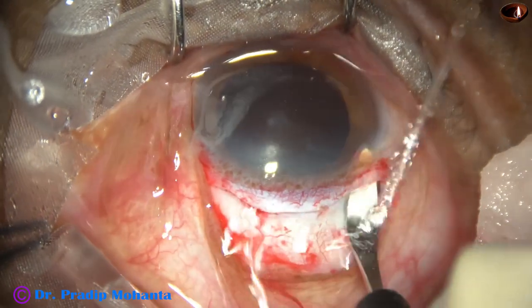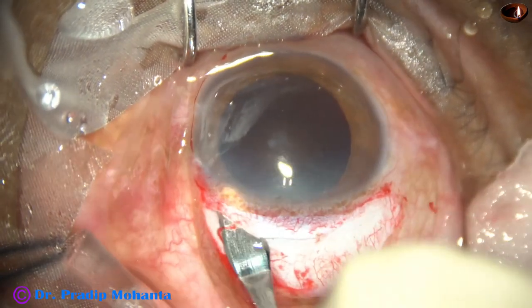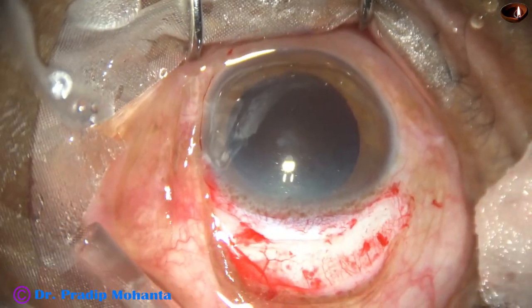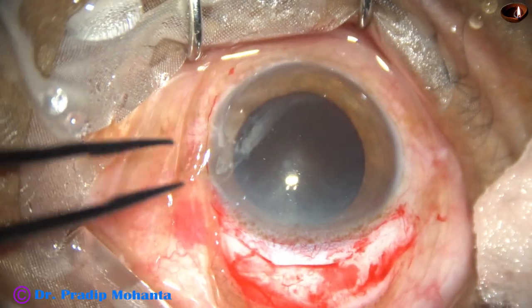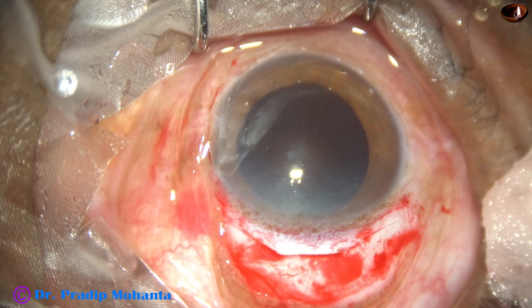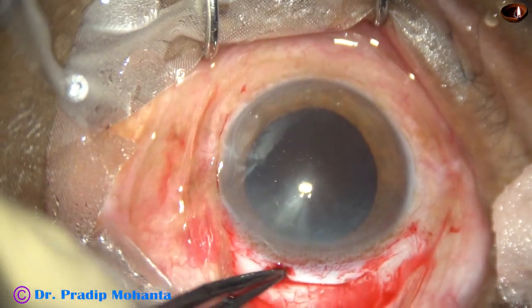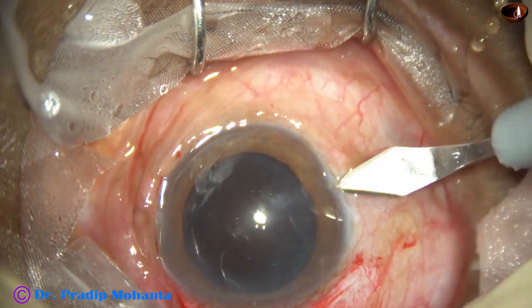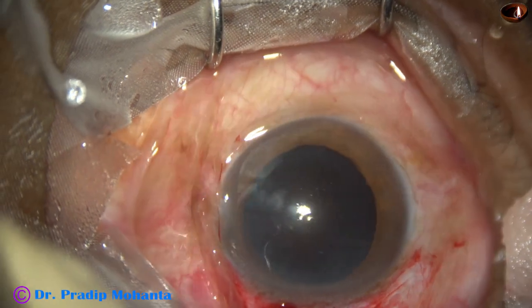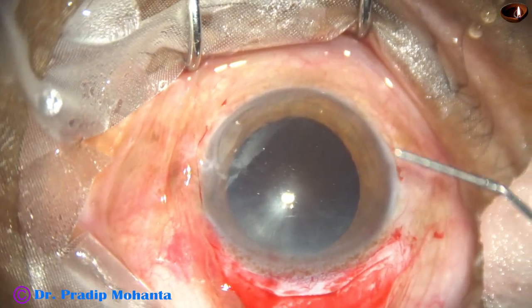Sclerocorneal tunnel is made. The inner incision is going to be about 10 millimeter. The outer incision is about 9 millimeter. And we will see how easily this very hard nucleus comes out through this large wound. This is a side port at around 9 o'clock or 8:45 o'clock.